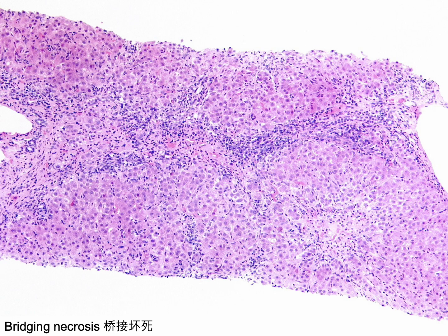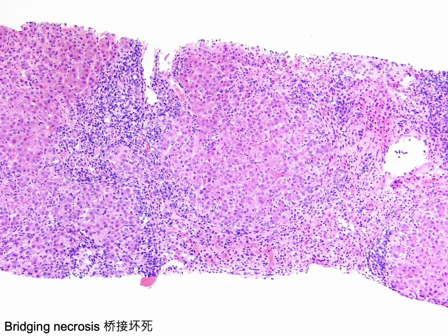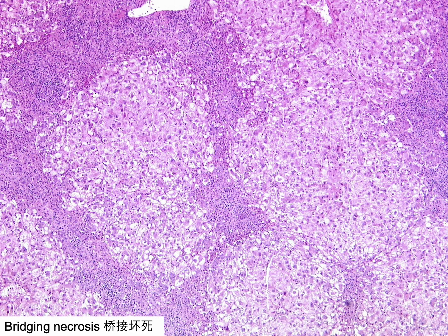A large area of hepatocyte loss with inflammatory infiltrate connects a central vein on the right with a portal tract on the left. In the classical Lobular model, this is known as portal-central bridging necrosis; according to the Rappaport Acinar model, it represents extensive zone 3 confluent necrosis. Bridging necrosis indicates highly active and severe damage to the liver parenchyma and can occur in acute viral hepatitis, drug-induced liver injury, and autoimmune hepatitis. Extensive bridging necrosis with islands of remaining hepatocytes exhibiting hydropic changes is not uncommonly mistaken for bridging fibrosis or cirrhosis.